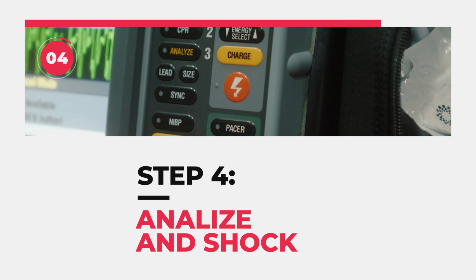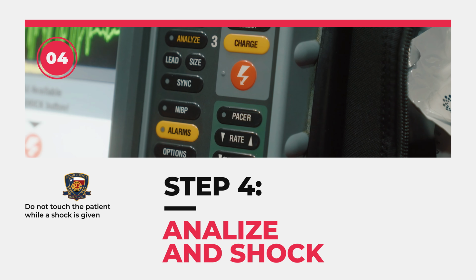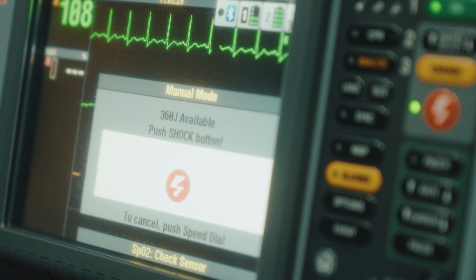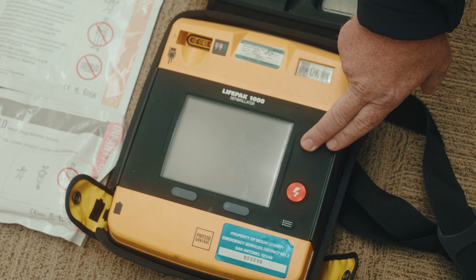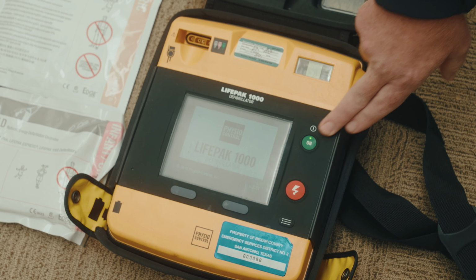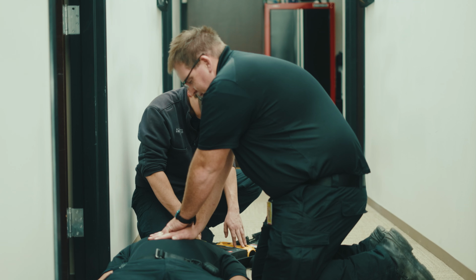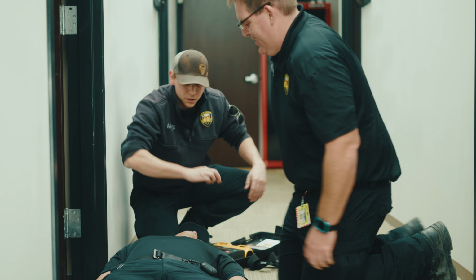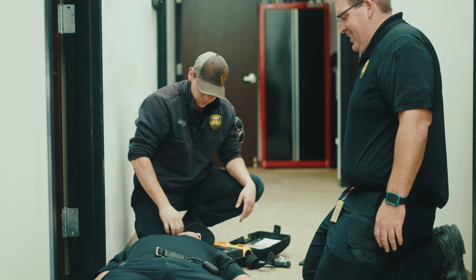Step 4. Analyze and shock if indicated. Once the AED pads are applied and the connector is plugged in, the AED will begin to analyze the heart rhythm. It is very important that chest compressions are stopped and that nobody is touching the patient during this time. The AED will indicate if a shock is indicated. Once the AED indicates this, do not allow anyone to touch the patient and depress the shock button on the AED to deliver the shock.